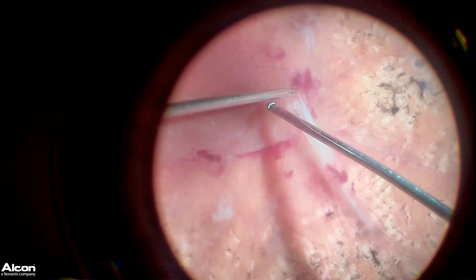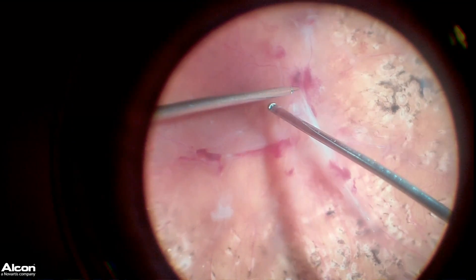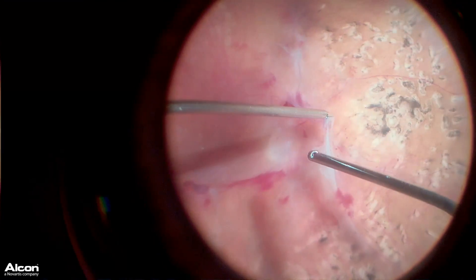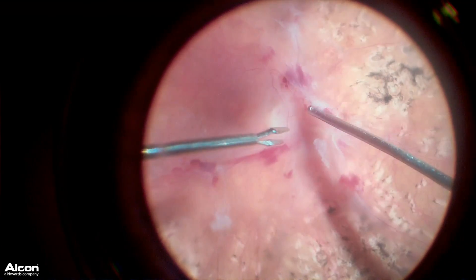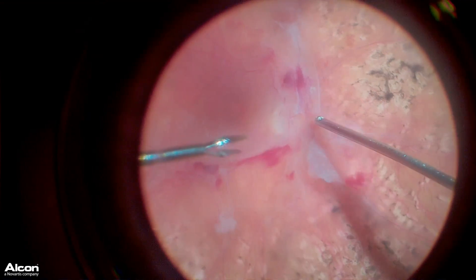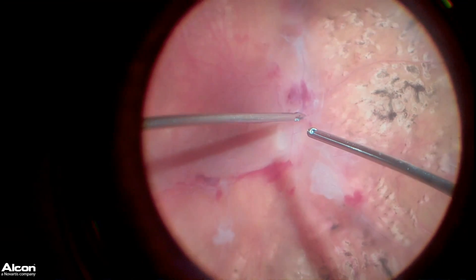I've found that using the Ingenuity 3D viewing system allows me the ability to use both hands along with chandelier illumination, so that way we don't have to hold a light pipe — which is really very beneficial in clearing this scar tissue. What I'm doing here is using the Max Grip forceps to lift the scar tissue off the surface of the retina.